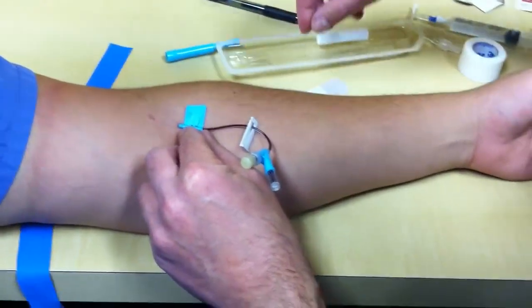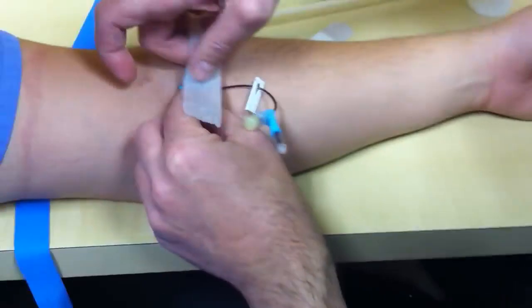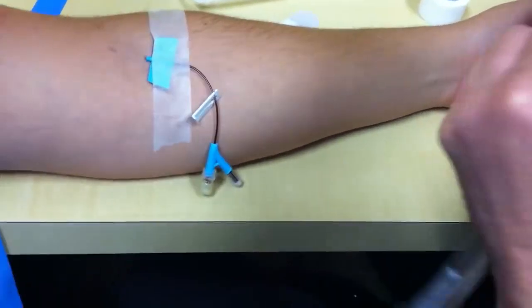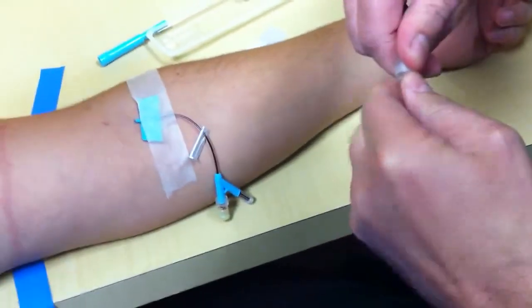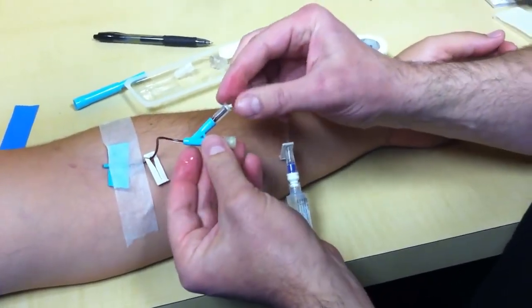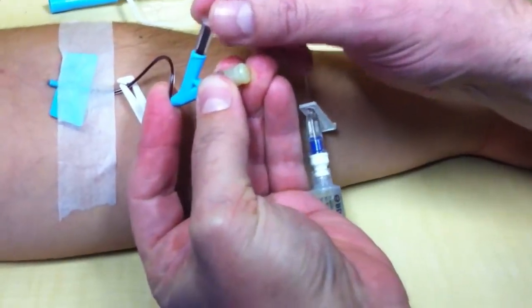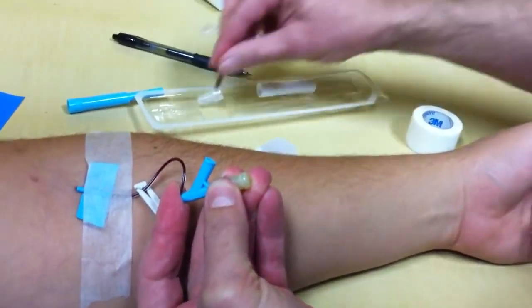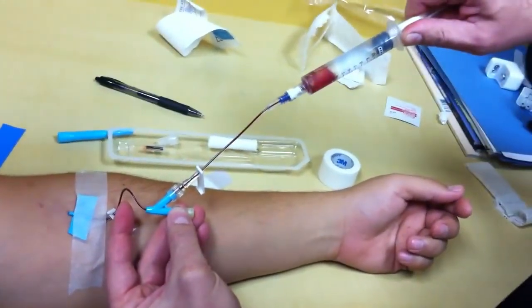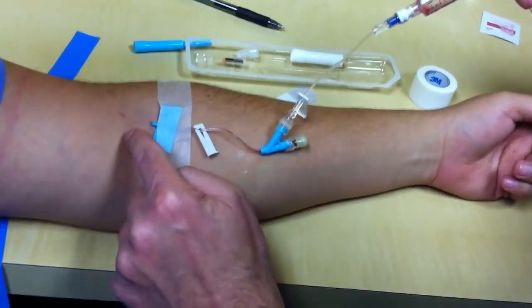We let the band go. We got blood in this thing, and we get our piece of tape. Put one piece across here. Don't cover the area where the catheter is in, because when you inject your saline to test your line, if that area is covered up and it infiltrates, you're not going to see it. If I pull this cap off, blood is going to flow out — however, if I fold this over, now when I remove the cap, no blood flows out. Attach your saline line. Withdraw to get all the bubbles out, then inject slowly. It should be zero resistance, very little resistance, and no infiltration.